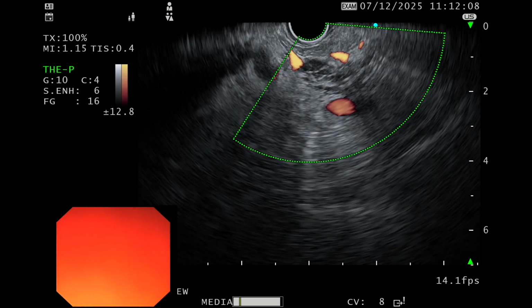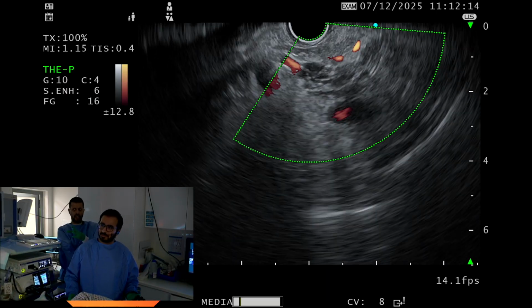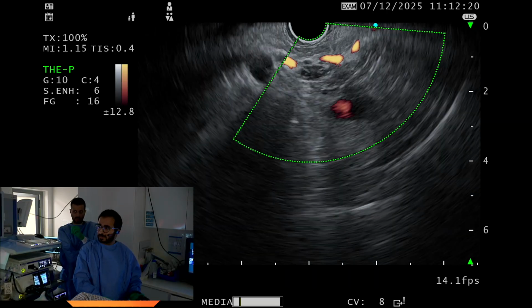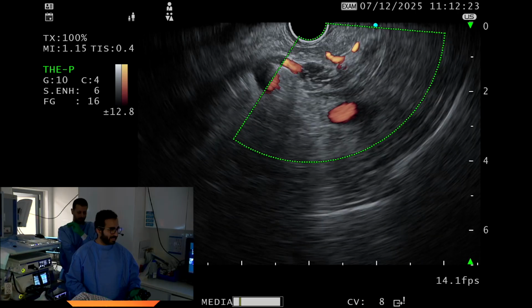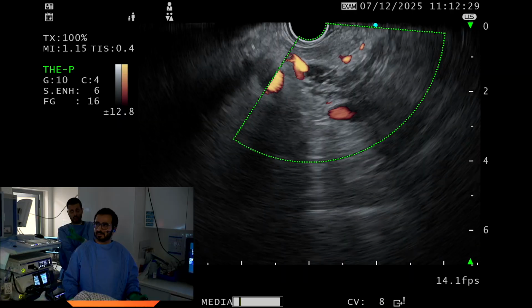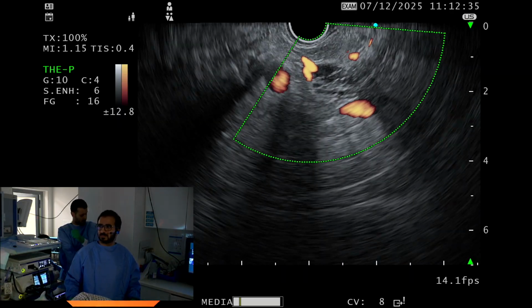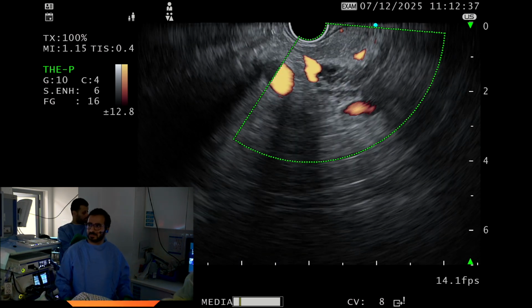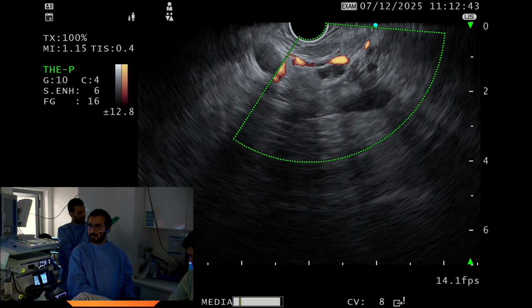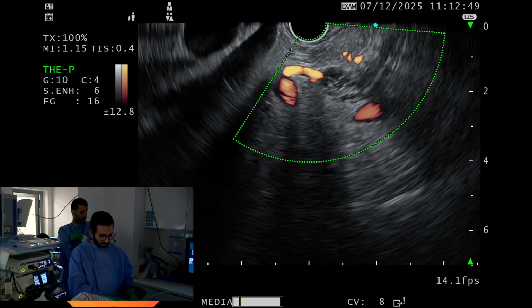I think a very valid point. We were discussing, me and Dr. Adel initially. First of all, I do agree. I think this is a conglomerate of side branch IPMNs, especially that it's not only in the head, there are a few cysts in the body and the tail that goes a bit against the serous cystadenoma. And there are no worrisome features here in terms of pancreatic duct dilation. So I agree. I think that's pretty reassuring as long as the patient continues to follow up regularly. I think a very tailored approach with the patient is very important. I would repeat EUS for this patient every year or alternate with MRI. And exactly like you said, we would probably be subjecting this patient to a total pancreatectomy, given the cyst burden of the body and the tail.